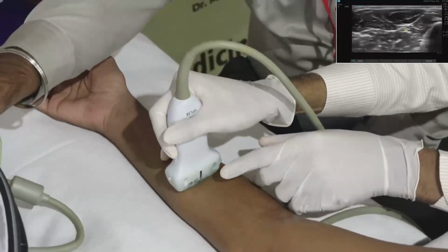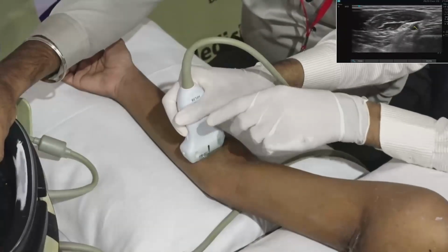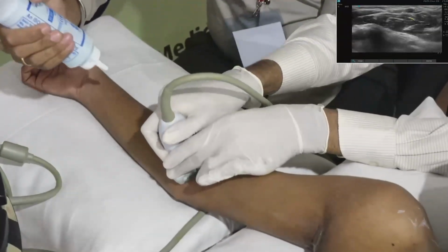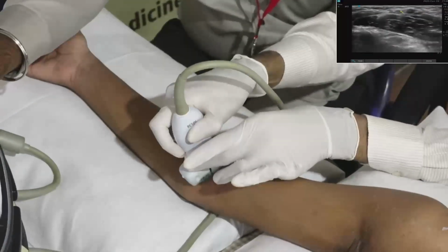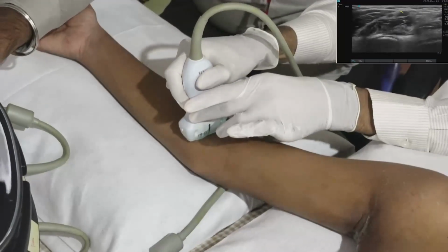If you trace the median nerve from here, it is nicely seen, and it comes next to the brachial artery. It is medial to the brachial artery. Again I am tracing the median nerve.